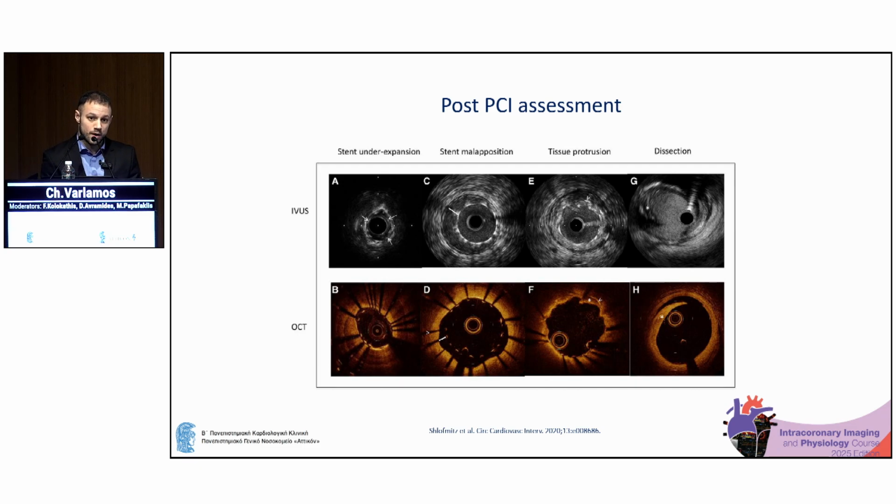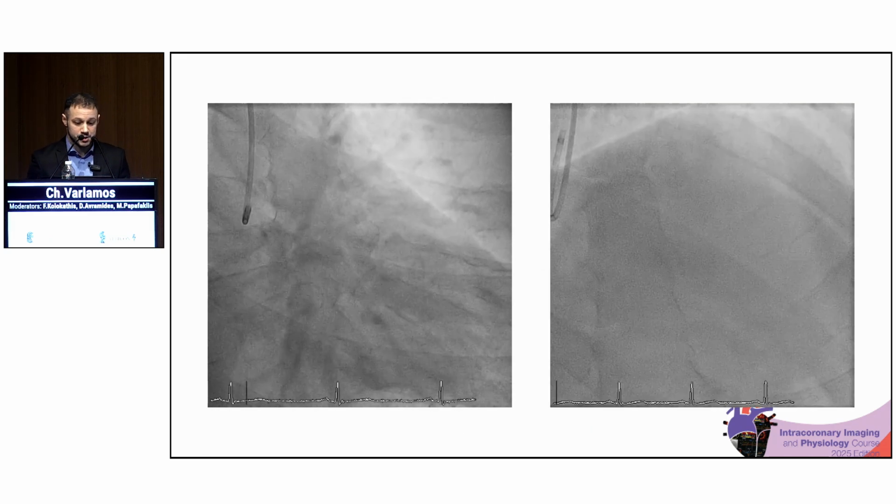You all have knowledge of this. We talked before about stent under-expansion, stent malapposition, tissue protrusion, dissection. We check and we optimize our results.